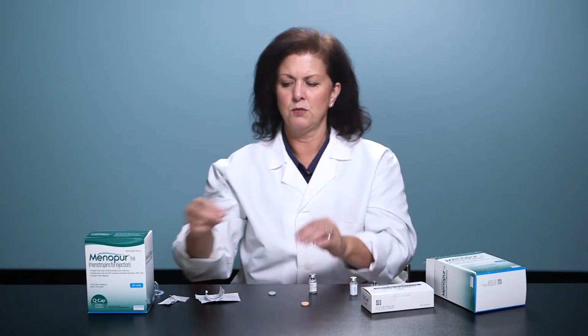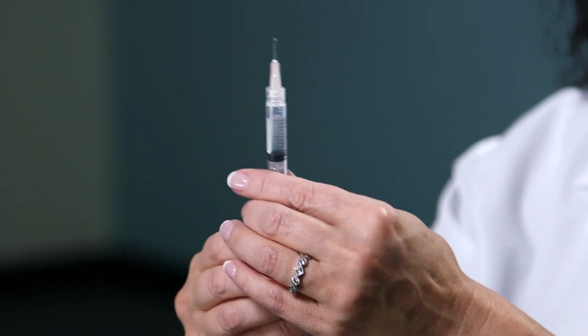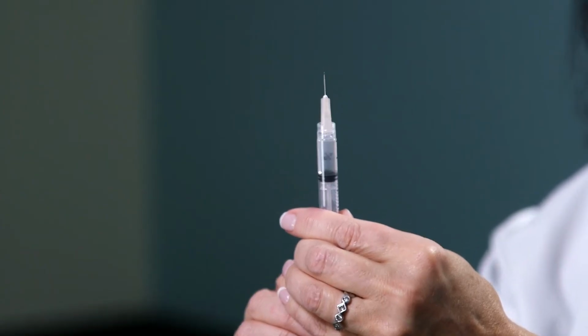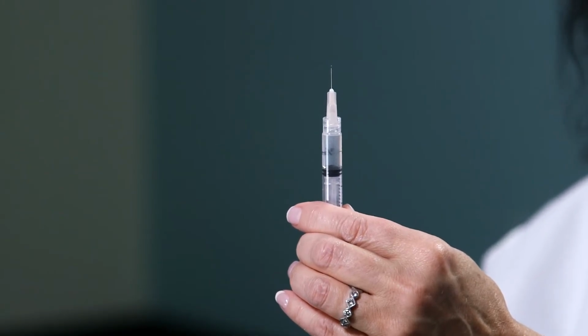You're then ready to attach your 1/2-inch needle for subcutaneous injection. Tap any air bubbles so that they rise up to the top, and push on the plunger gently until you see a droplet form, and you're ready for your subcutaneous injection.